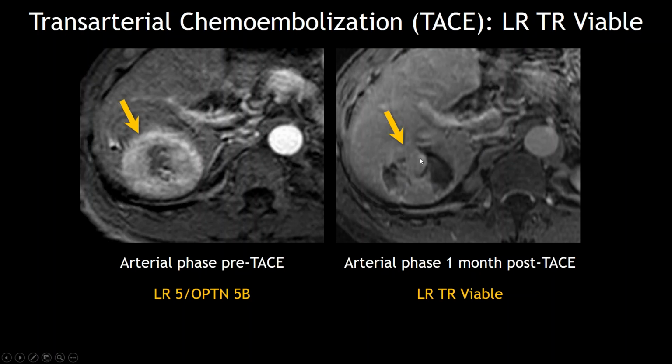The reason though is the type of... so you can see here what necrosis looks like. There's just no enhancement. So even here, it's not arterially enhancing. Well, we know this is not the right phase, but even if you said portal venous, should there be washout, you know that there's still signal in it. It's still enhancing, right? It's iso enhancing to the parenchyma, so there's still enhancement there. And given that there's still enhancement in that tumor, you know that there's viable tissue because it was TACE.